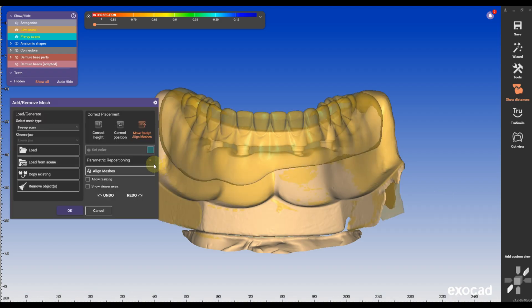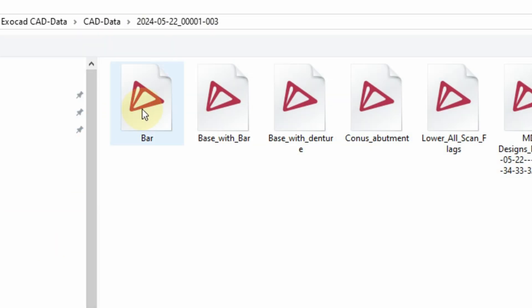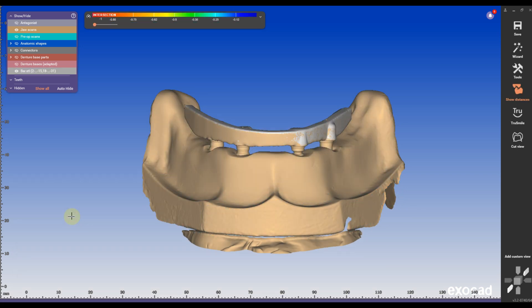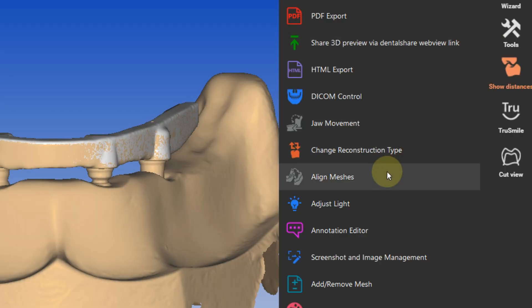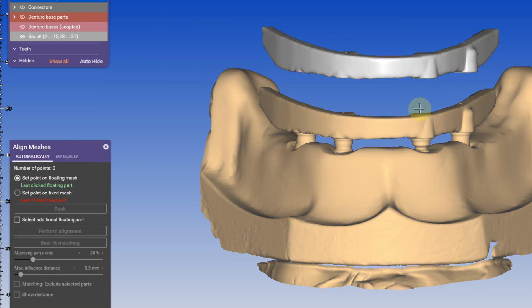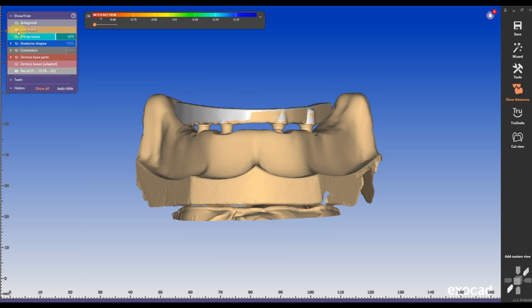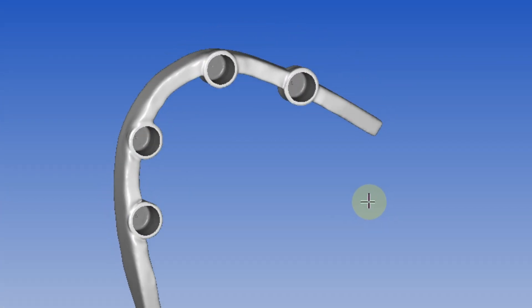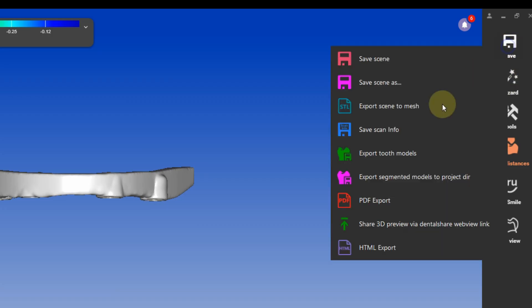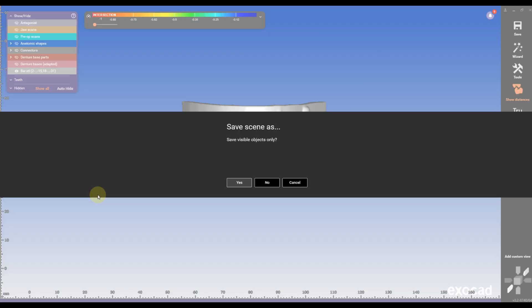It might look like it is aligned perfectly, but to make 100% sure, go under align meshes and align the bar manually again by selecting a couple of points. If it turns blue, it's perfect. Export the newly aligned bar mesh again, double-checking that there are no extra meshes in the picture — if you see any extra meshes, you will have problems later on. Export the scene again as a mesh.